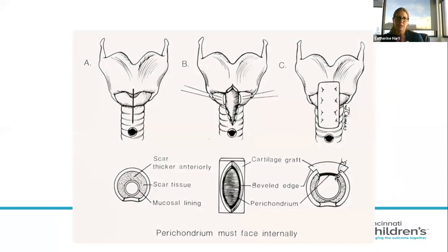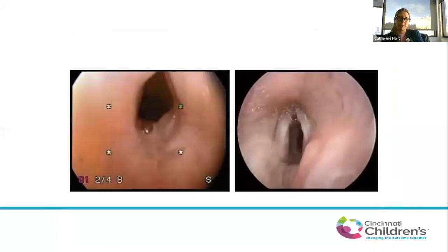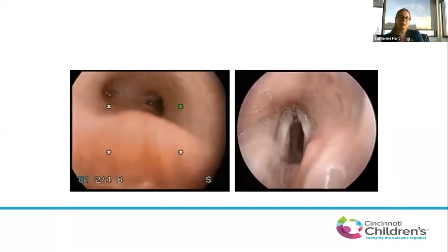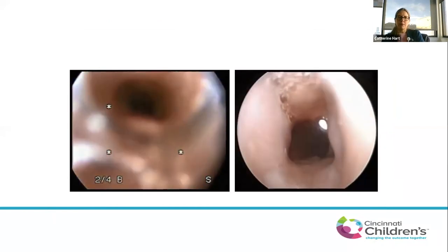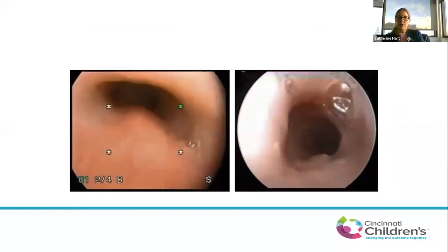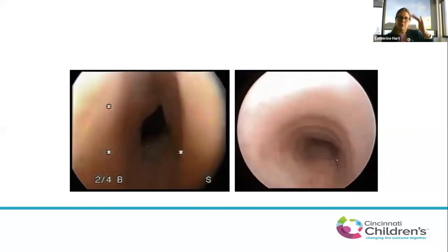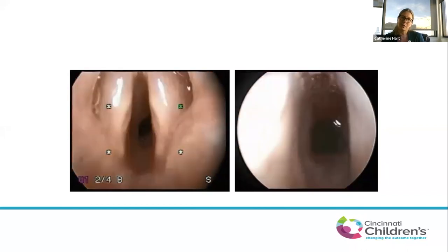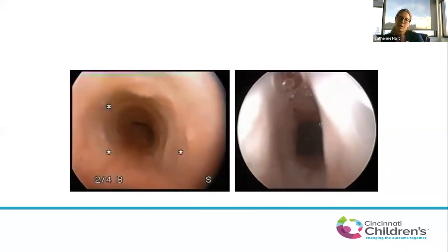This cartoon depiction shows the same anterior graft steps. You can see the boat shape of the cartilage sitting down into the airway, expanding the cricoid cartilage framework. This patient was treated with a single stage anterior graft alone for a fairly isolated low-grade subglottic stenosis. At followup, the cartilage is integrated nicely into the airway, and although there's still slight narrowing, they now have an adequate airway.